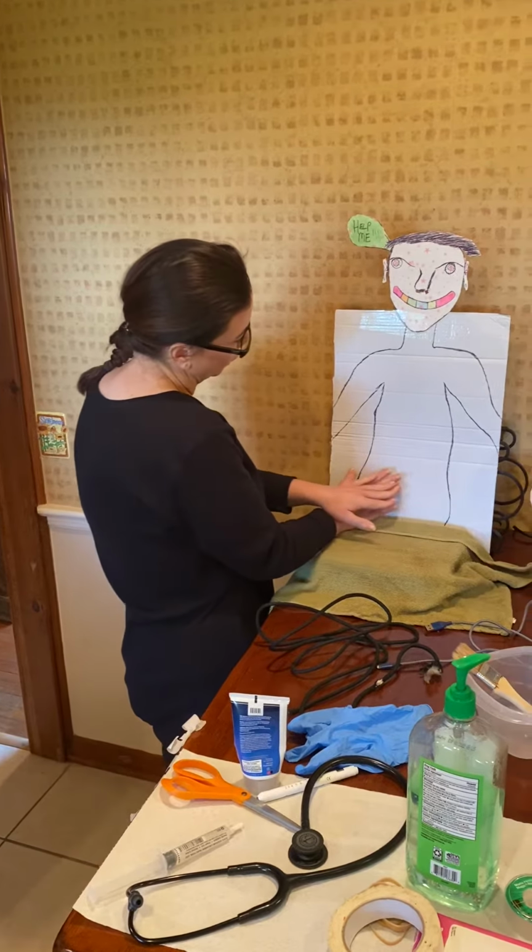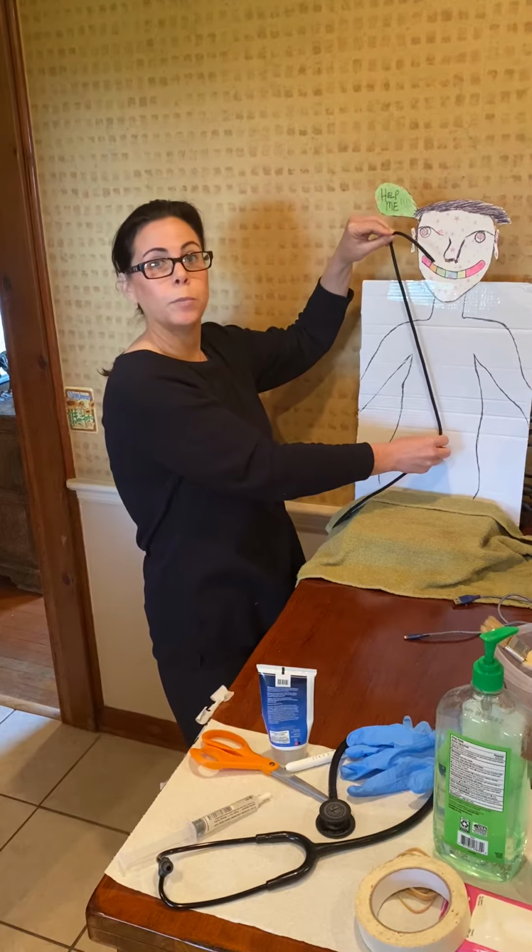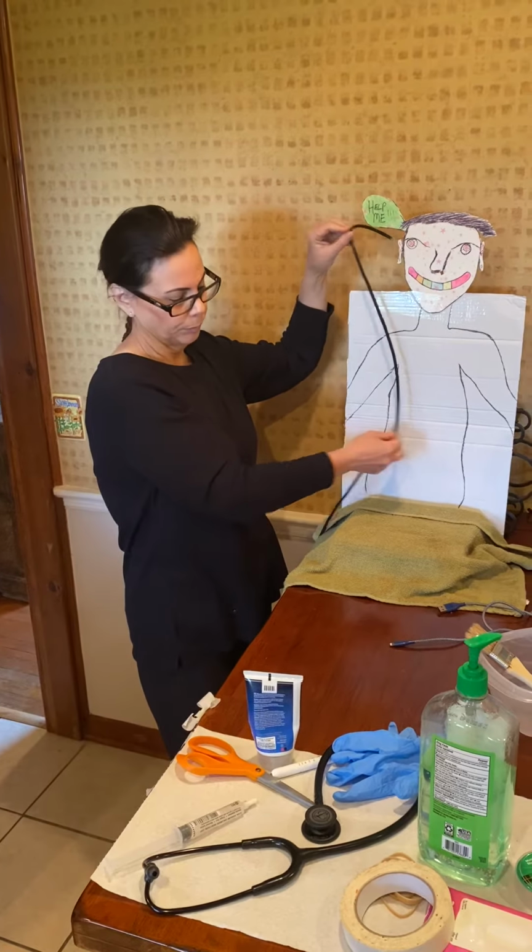So now we are going to measure. I just completed my focused abdominal assessment. I've got my NG tube here. What we're going to do is measure from his nostril to his ear, and then from his ear to the xiphoid process, and I'm going to leave about an inch or two below, and I'm then going to tape that. So I have that marked.